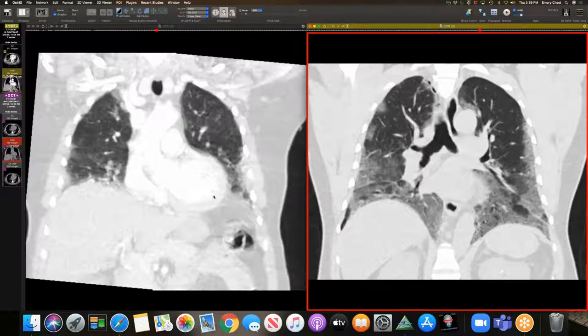And I think that argues for the role of CT. Sometimes they have fever, right? They have an acute phase reactant type thing. If you have the upper respiratory symptoms, it may be helpful. But this case also illustrates why using CT to decide COVID-19 or not is, in my thought, just ridiculous. Yes. This patient ended up being COVID-19.